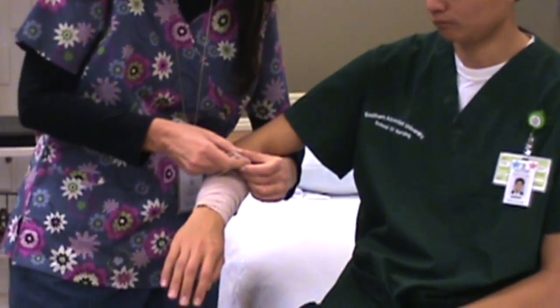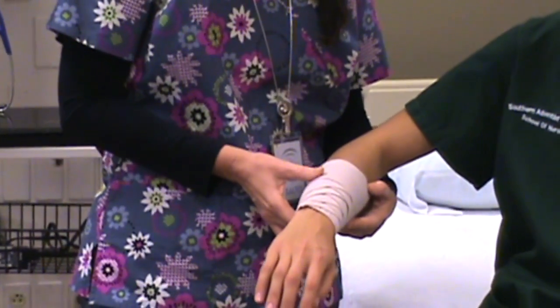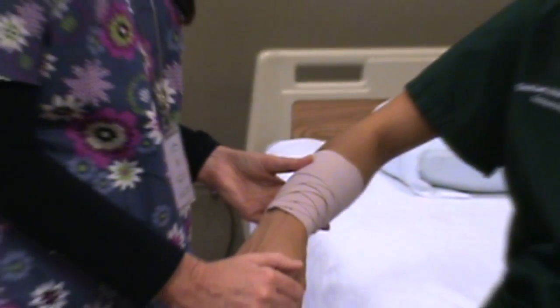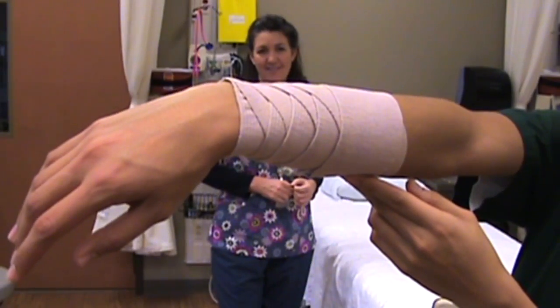And then after you're finished, you want to tape it. Throw those little clips away that come with the ace bandage. Tape it in the hospital so the patient doesn't lay on it or something. It doesn't come loose. And then you want to check their extremities to make sure that you haven't wrapped it too tight. So this is your reverse spiral right here. Ta-da!